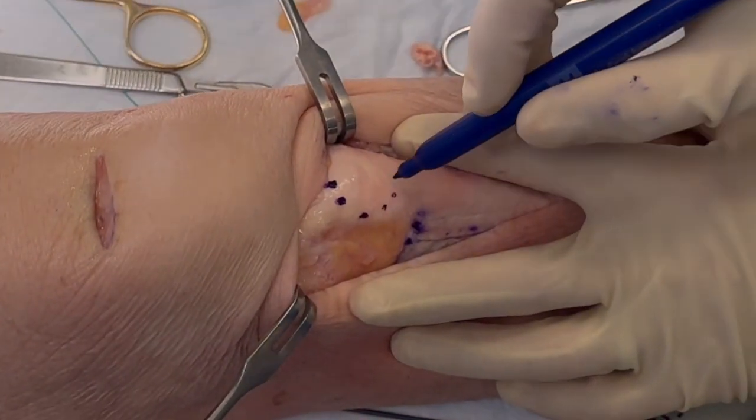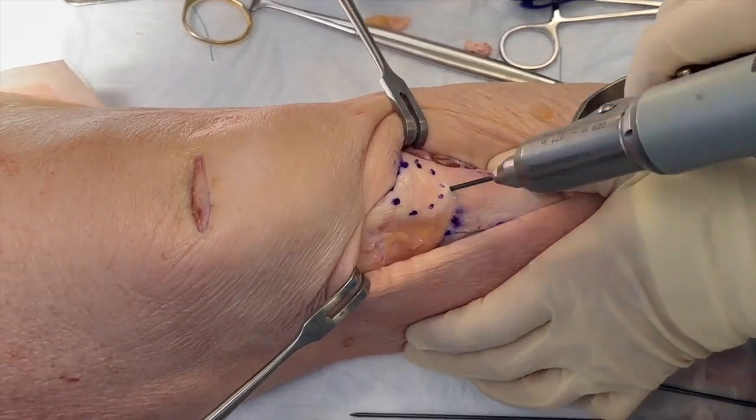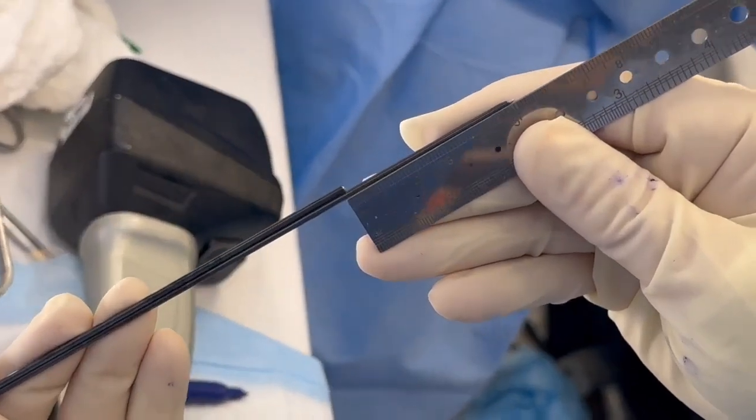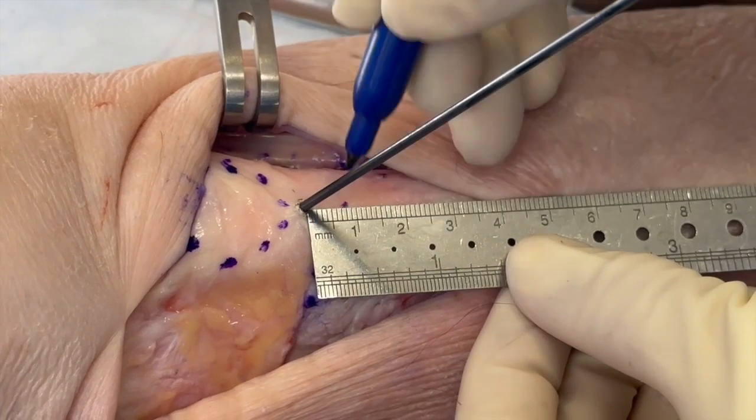I'm marking here the tibial tubercle. This is an infratubercular HTO. I place one pin. I measure the length of the pin to the posterior cortex to protect the neurovascular bundle. Then I mark the closing calculated on pre-op MRI scans.